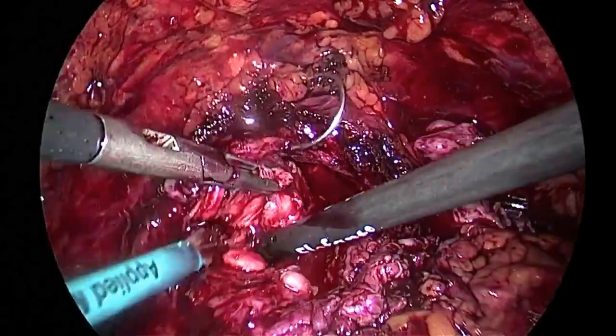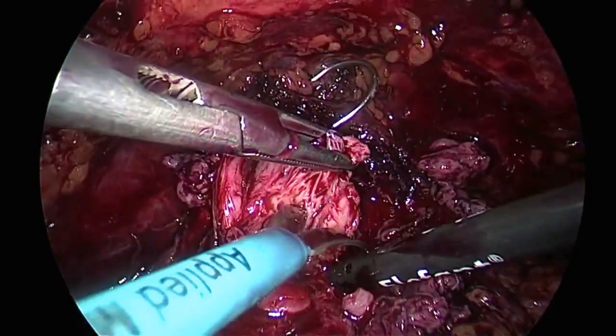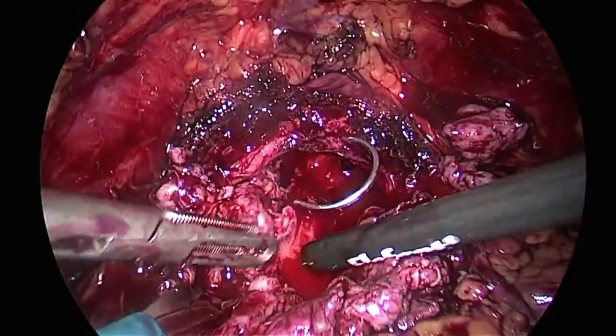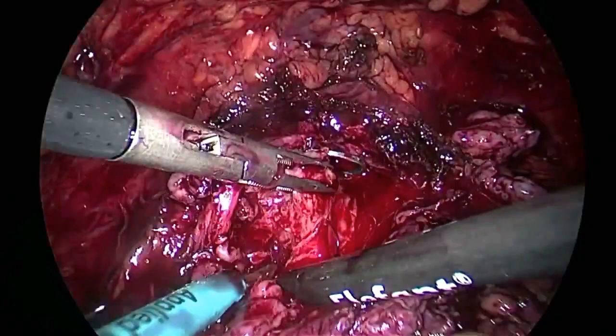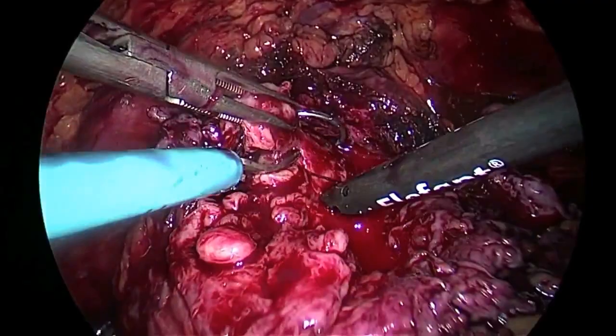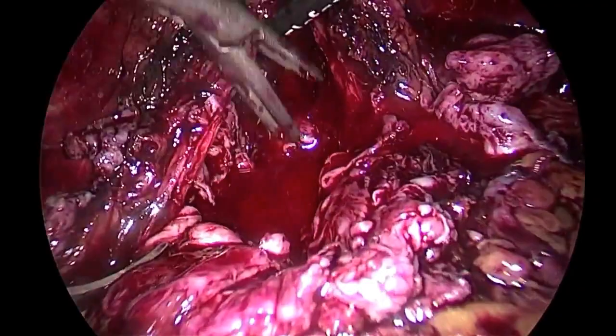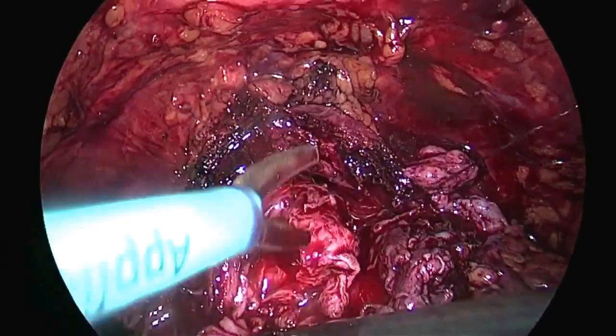Can you give me the possibility to look at well? Look very well here. That is adenoma. Yes, I think that this is a small adenoma, and I try to remove it in order to have a perfect suture, obviously. Sorry.